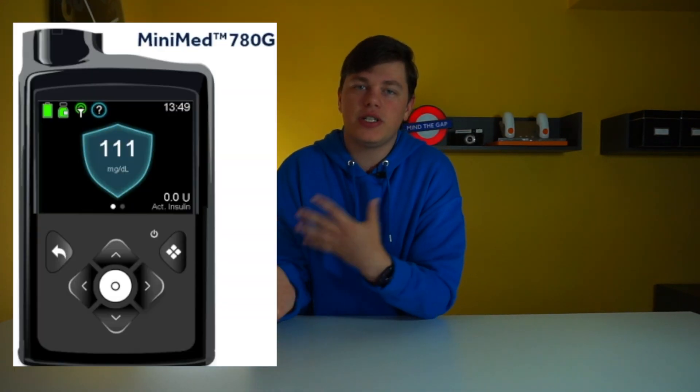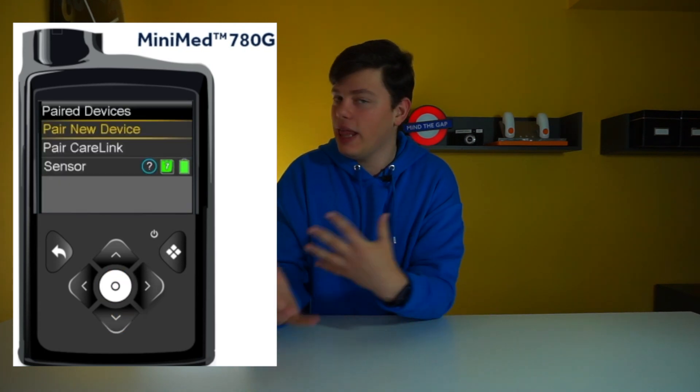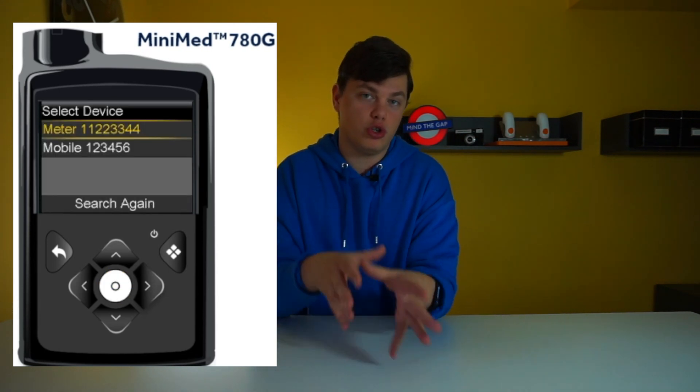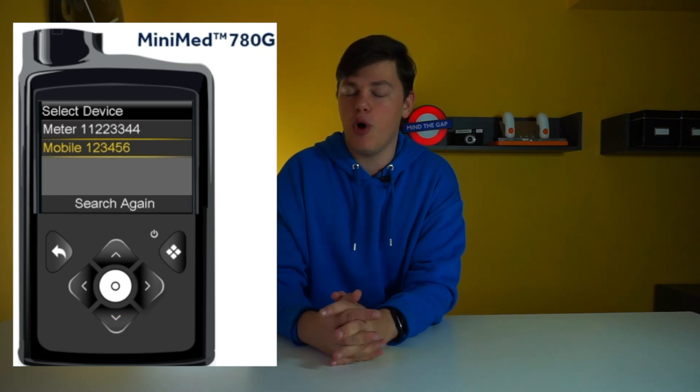Because the entire system is Bluetooth-based, there's now an iOS and an Android app. The app allows you to display all of your pump and CGM data, but it doesn't allow remote control — it is just for display purposes only. It actually took Medtronic quite a long period of time to embrace Bluetooth and connectivity on their pumps, but we're finally here.